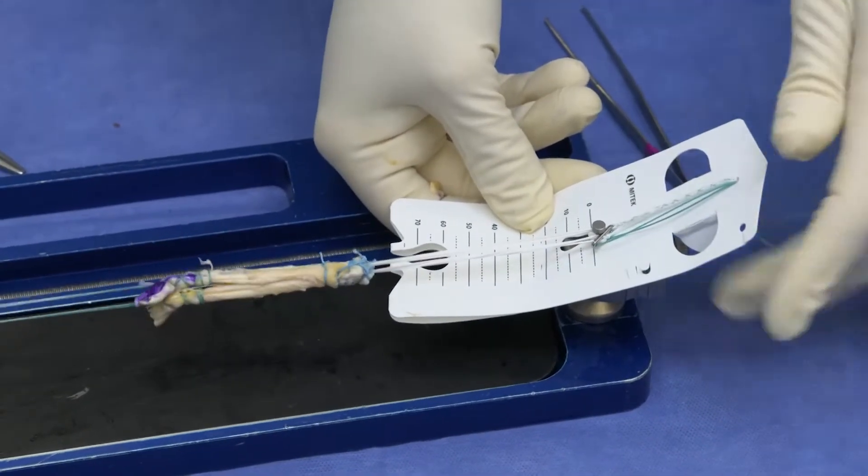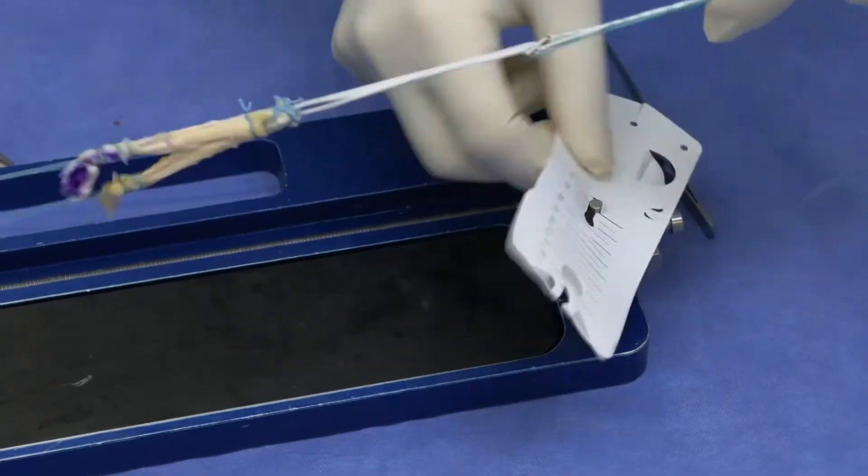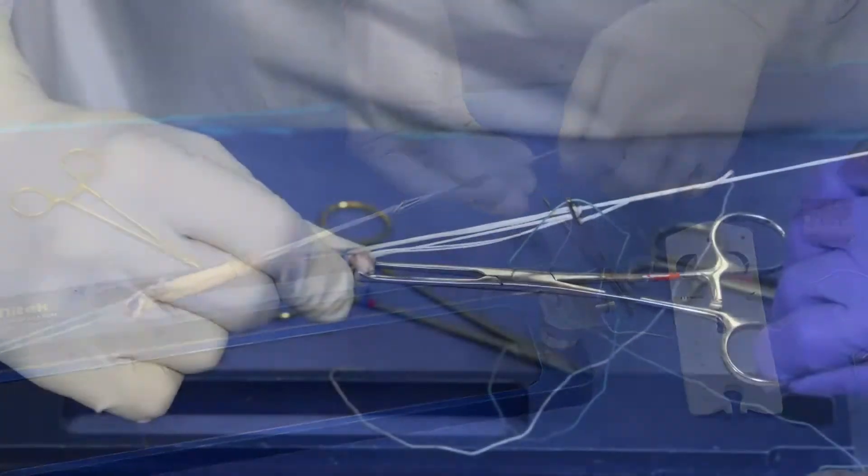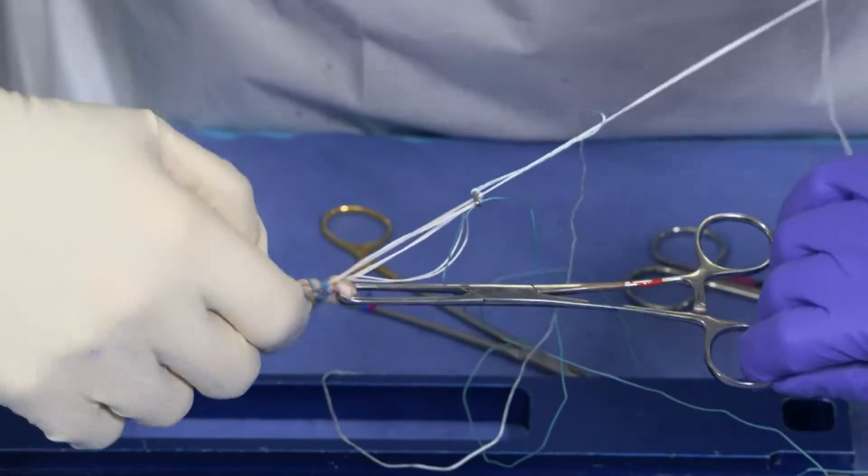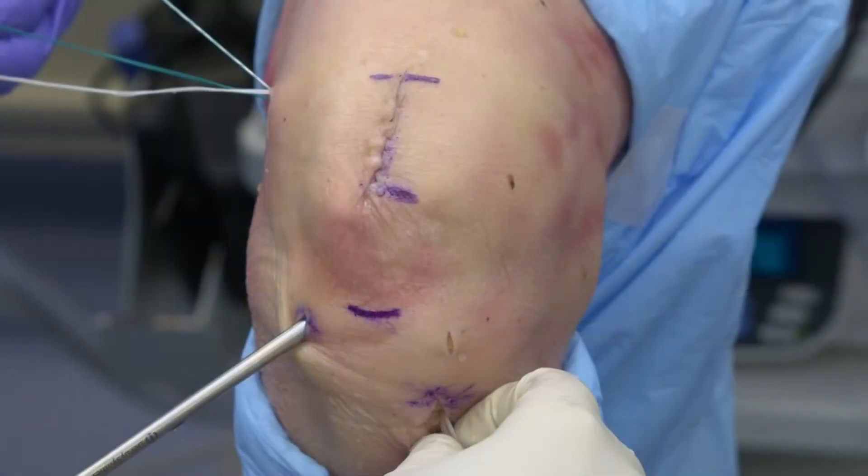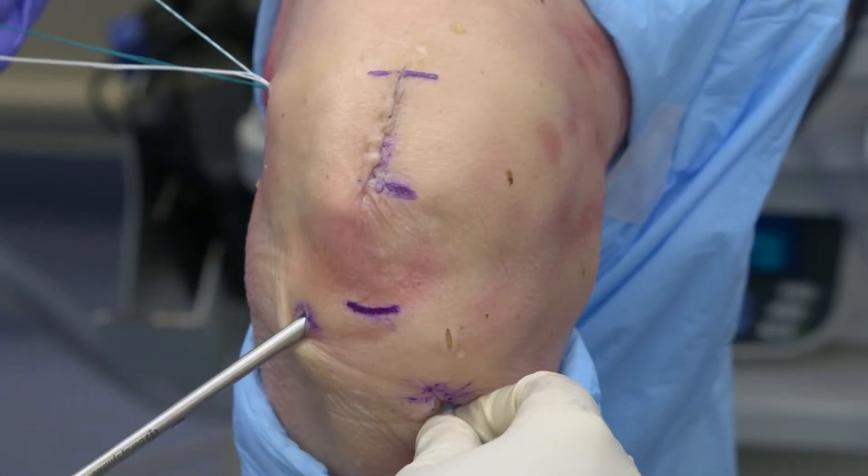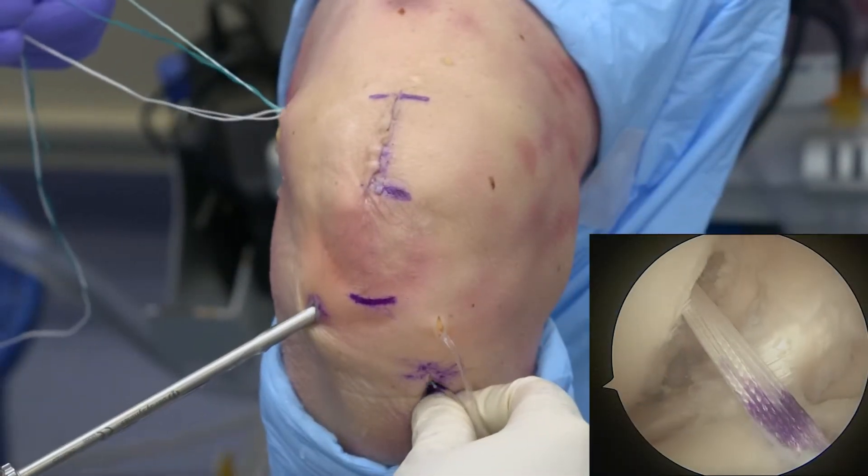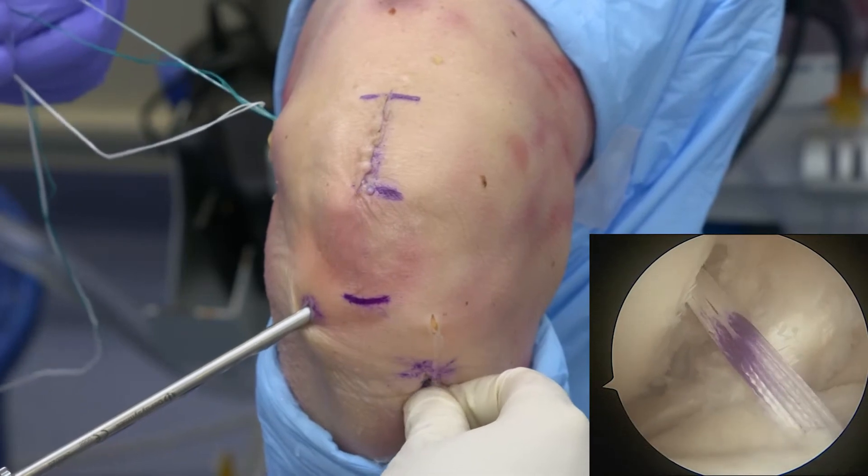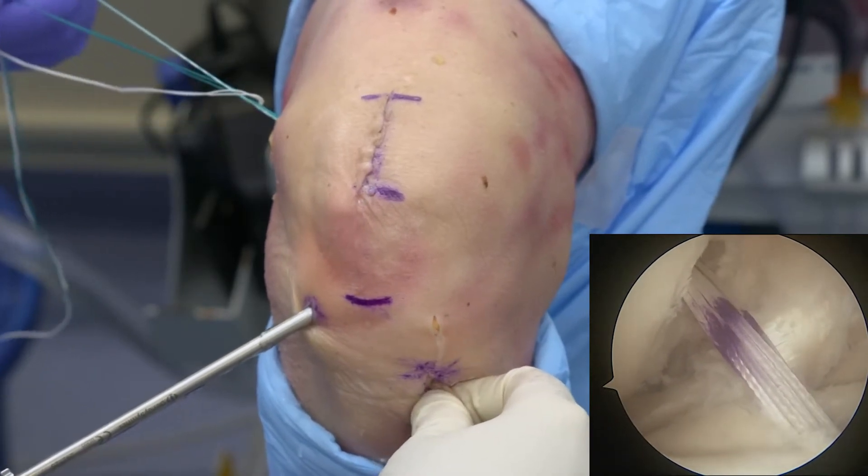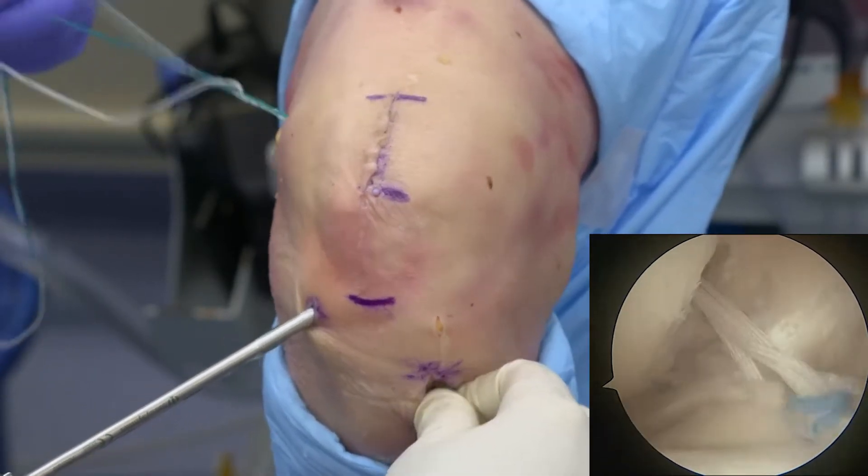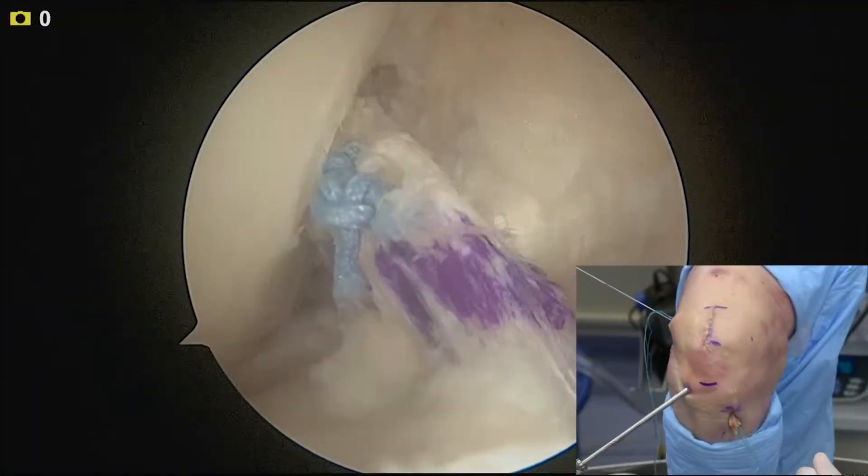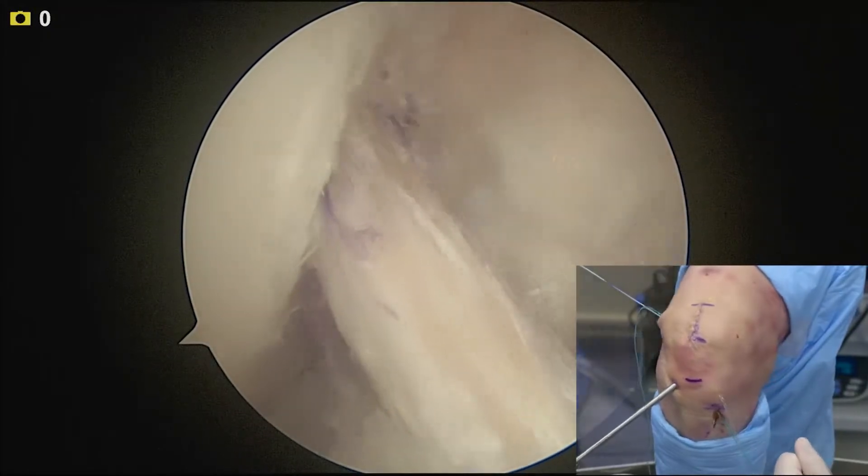Pull mainly on the green there. There's our marker, so when that goes to the tunnel entrance we should be pretty close. That's it, it should be coming. Yep, looks great. There's our docking point, that's pretty good.